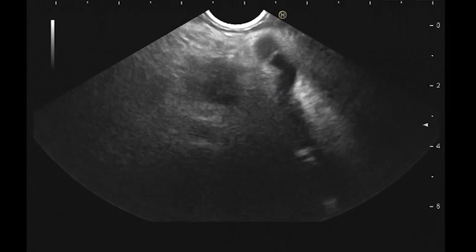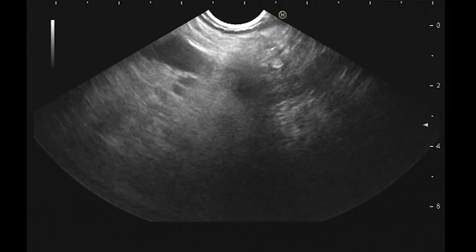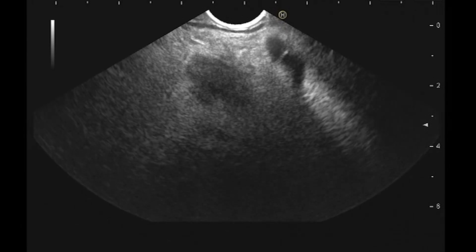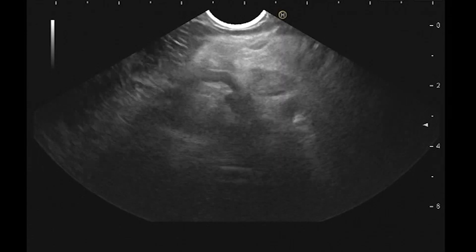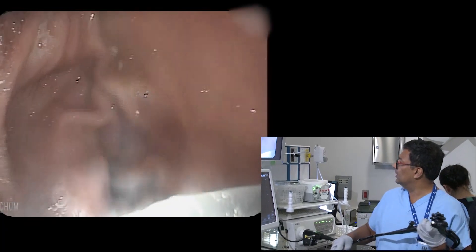We'll do a core biopsy with the Procore 20 for this, just to see if there's a transition zone. By the way, her portal vein is sort of going right into that. I'm going to go into the bulb now and take a look from here.